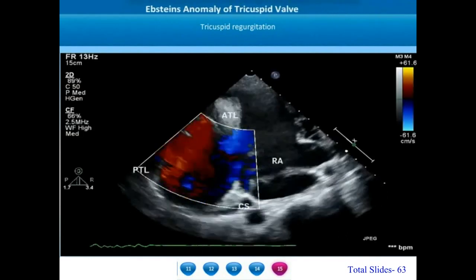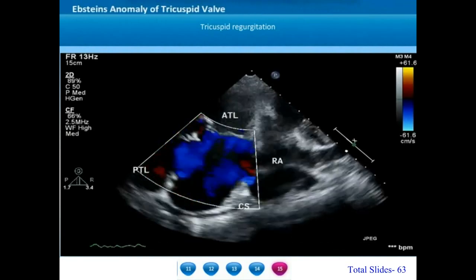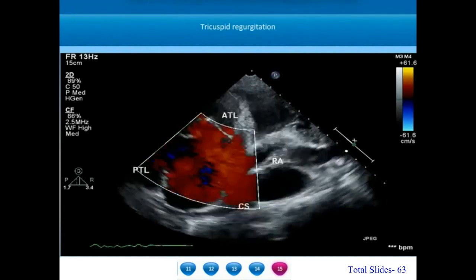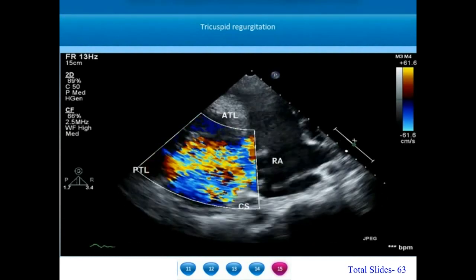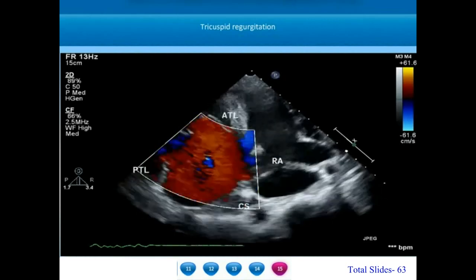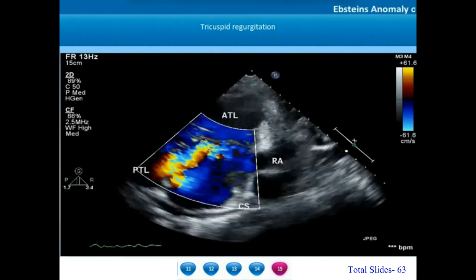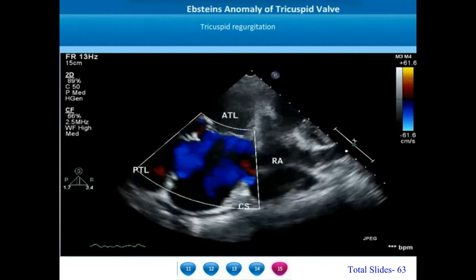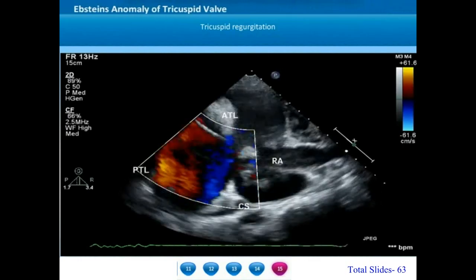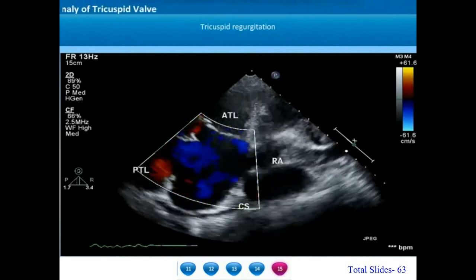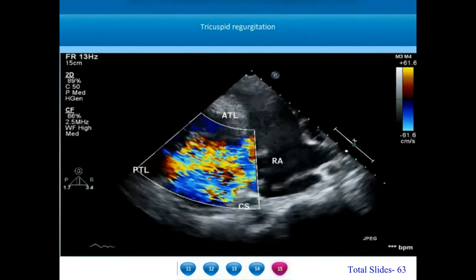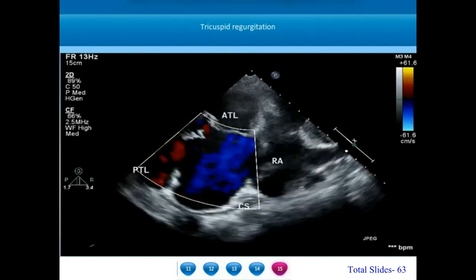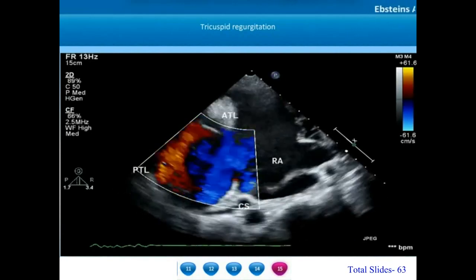On the same parasternal long axis view with rightward tilt, we can appreciate a broad jet of tricuspid regurgitation in this Carpentier type B patient with good mobility of the anterior tricuspid leaflet. The severity of the tricuspid regurgitation may not match with the mobility of the anterior tricuspid leaflet. If the mobility of the anterior tricuspid leaflet is very good, it is grouped under A and B, and even if associated with severe tricuspid regurgitation, these valves are repairable.